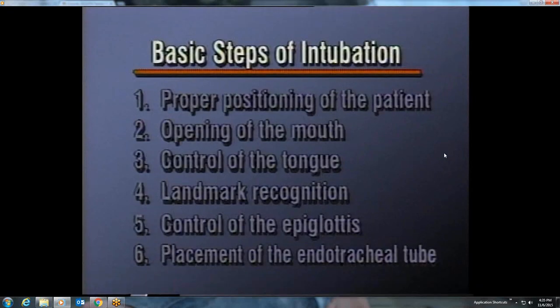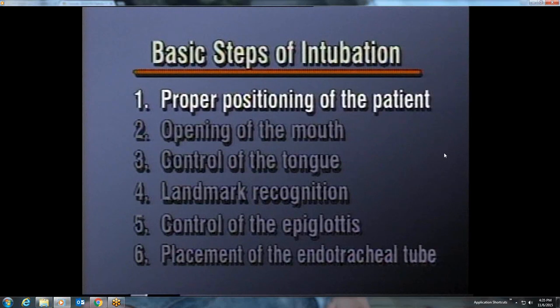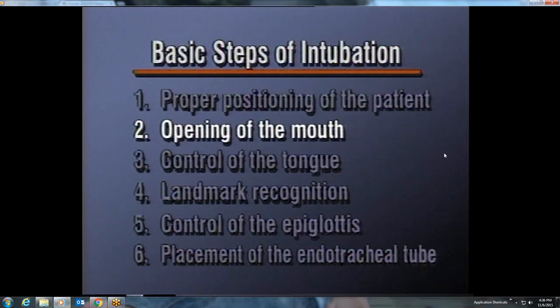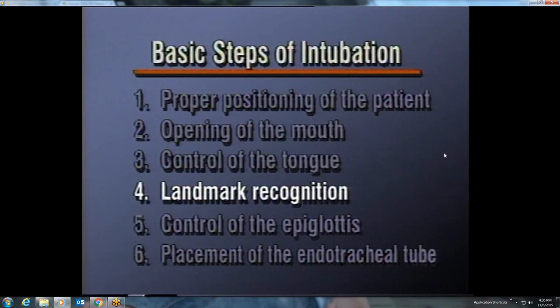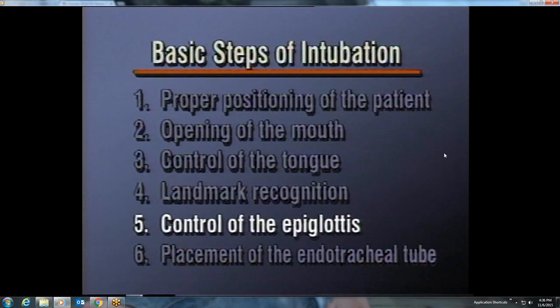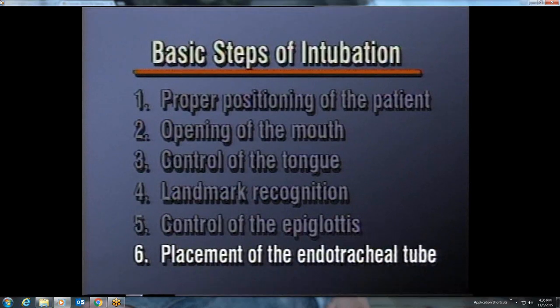The procedure of direct laryngoscopy and orotracheal intubation can be broken down into six steps: proper positioning of the patient, opening of the mouth, control of the tongue, landmark recognition, control of the epiglottis, and placement of the endotracheal tube.